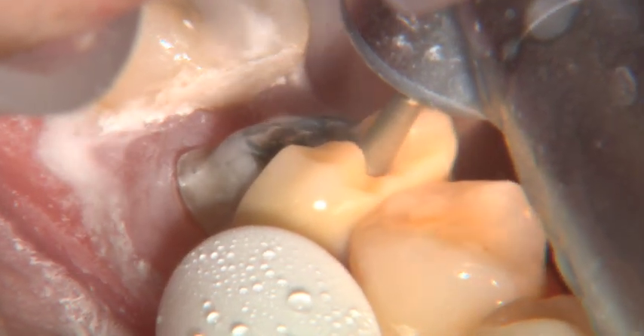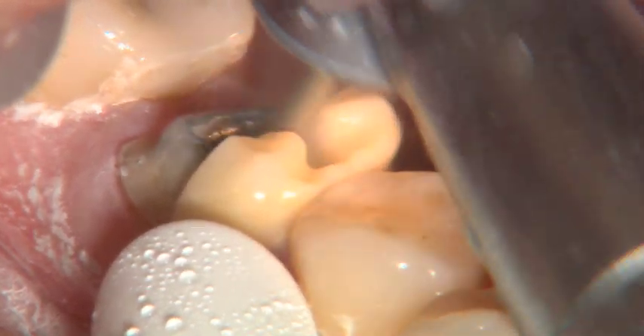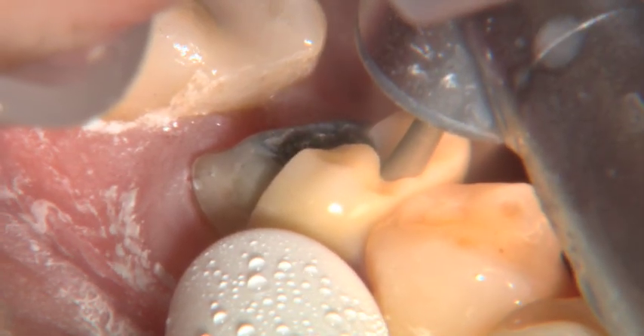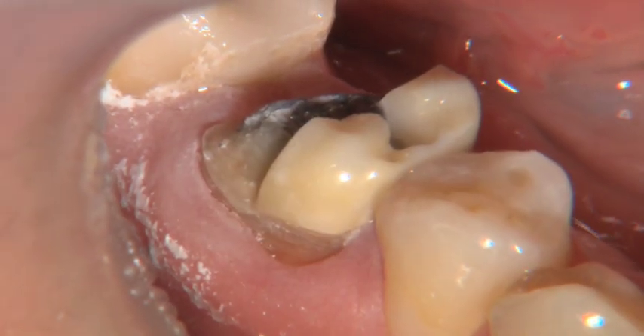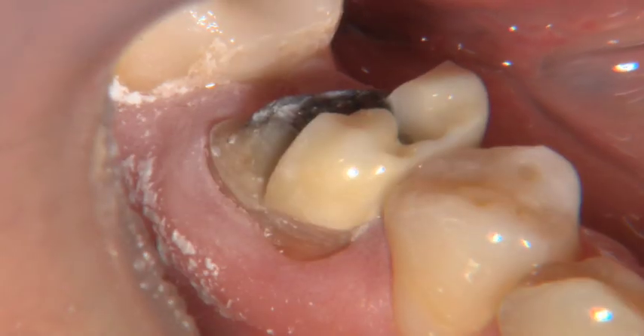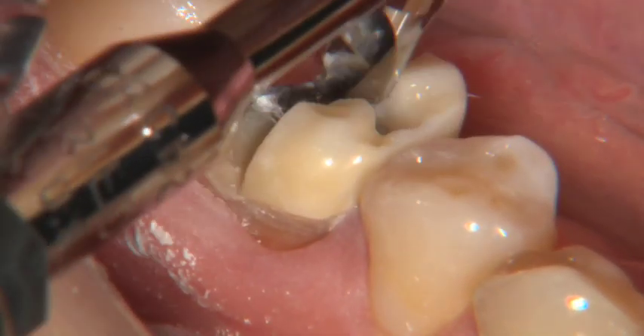This is one of the difficulties with all-ceramic crowns as opposed to a PFM — you can't bend the framework, bend the substructure, and then remove the whole thing. When you go to bend it, it breaks and you have to take it off in pieces. So typically we're taking off three, maybe four different pieces of crown — usually four, I would say.